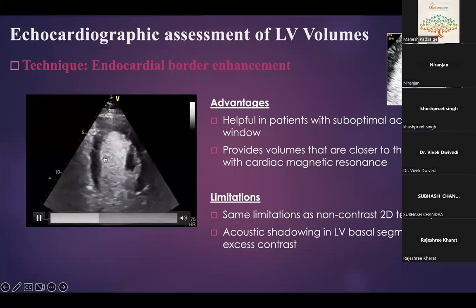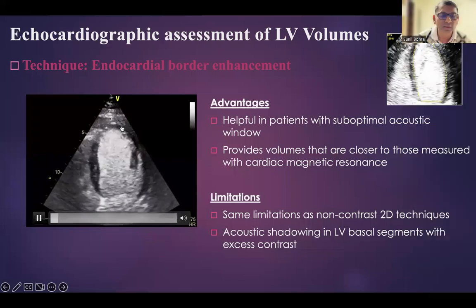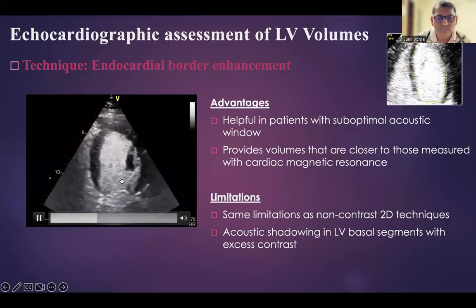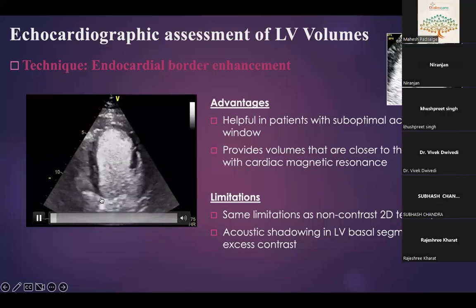Okay. So here I would like to bring to your notice. In this view, purposefully I put this image. Here you can see what foreshortening means.